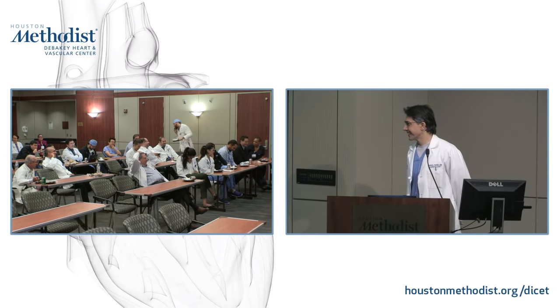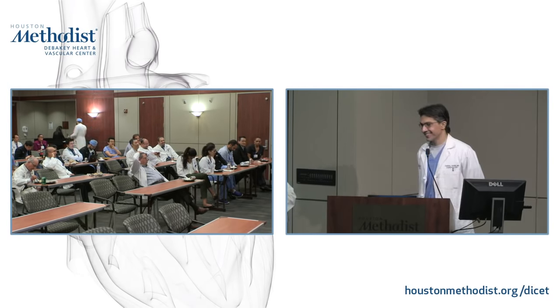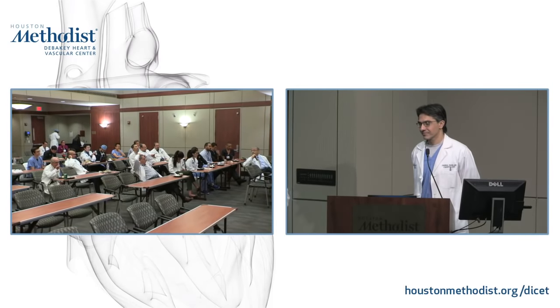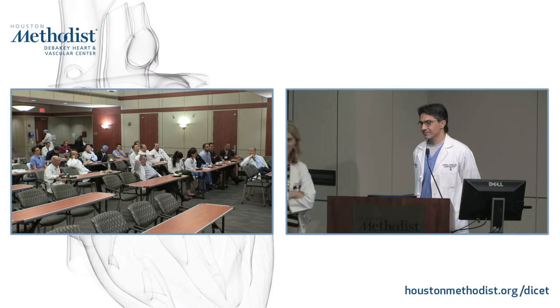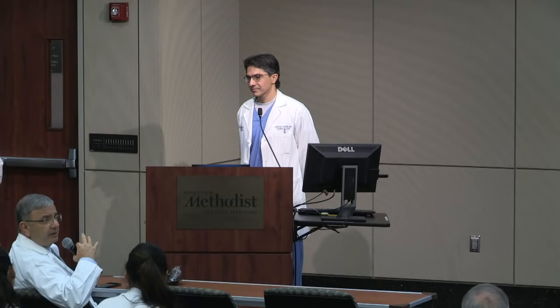All right? So for MR, if you have a small lesion that is very mobile, it will have problems. So it depends on what cohort you're studying. For echo, it is a problem in two things. One, the tomogram by which you're looking, because it's tomographic, and you may miss it completely, particularly in the apex.